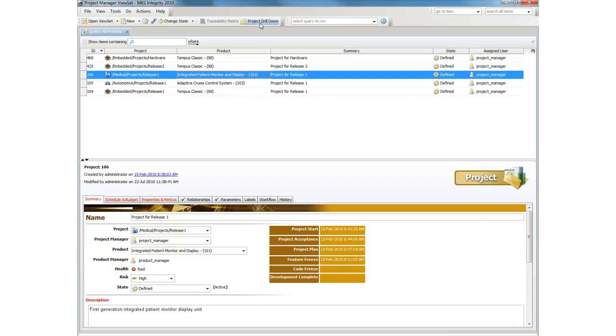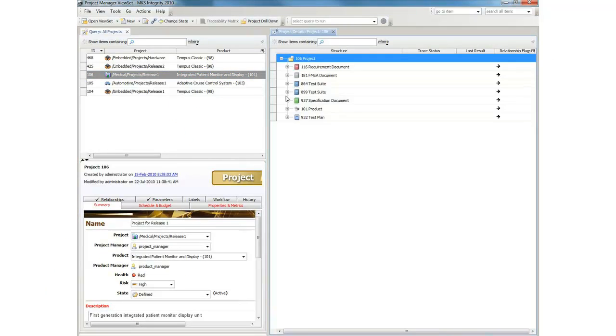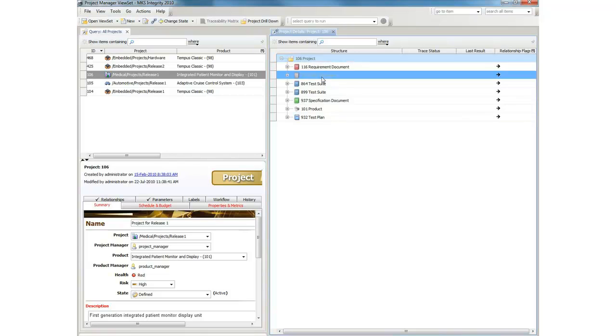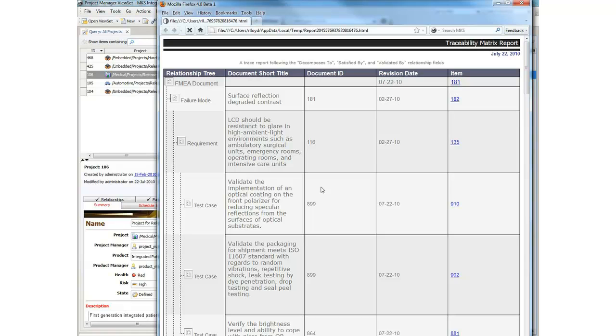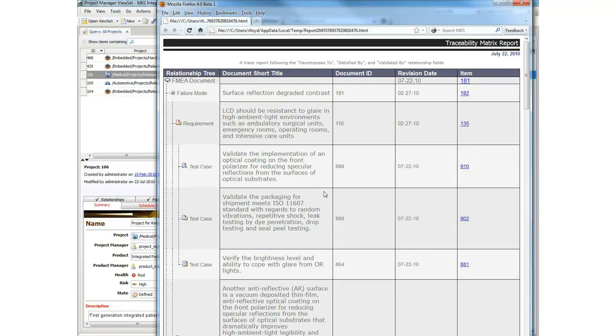The project manager selects the appropriate report at the appropriate level of the project, and MKS Integrity generates a report that can be shared with the FDA or other stakeholders in the project. These reports are configurable and can be tailored to your organization's exact needs.